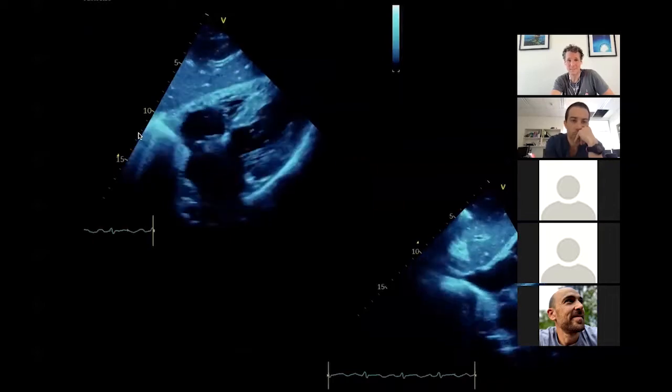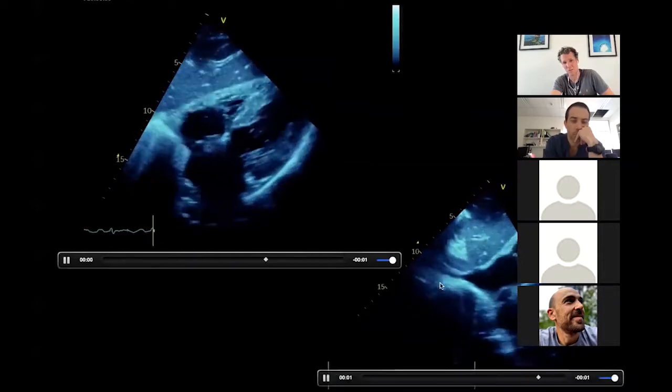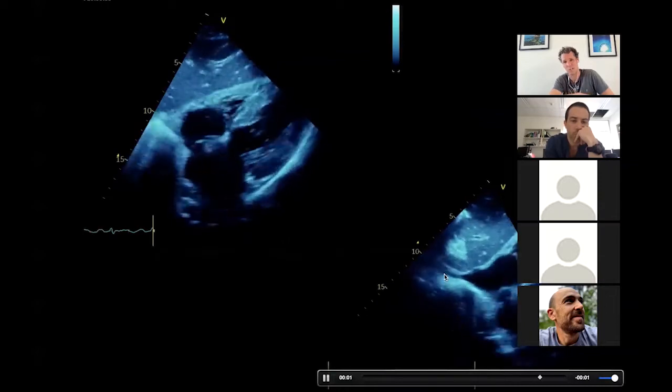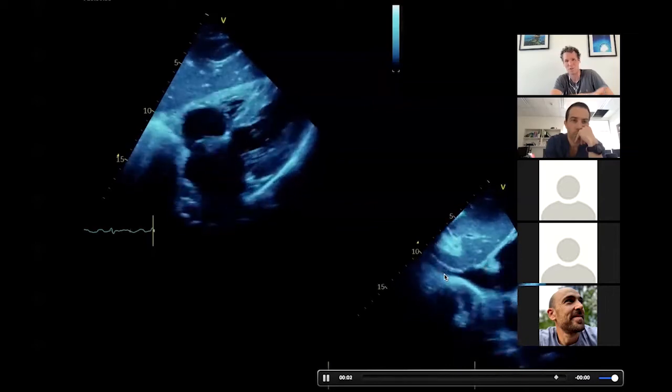Fluid status. Because we were concerned about the raised left atrial pressure here with the intra-atrial septum pushed over to the right, I think it's good to see the right atrial pressure looks small, almost completely collapsing. That's going to be close to a normal right atrial pressure. With all the pictures we've seen about a normal left atrial pressure and a normal right atrial pressure, these would be the kind of people where, if we do start to see hemodynamic instability, I wouldn't be pushing a lot of fluid into them, even though we've got normal right ventricle function at the moment. And with a guy with ARDS, obviously the last thing we want to do is push him over.